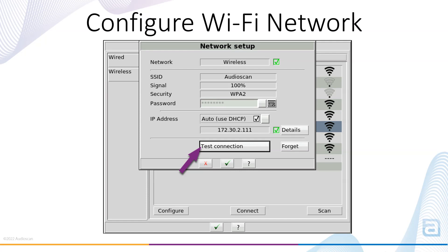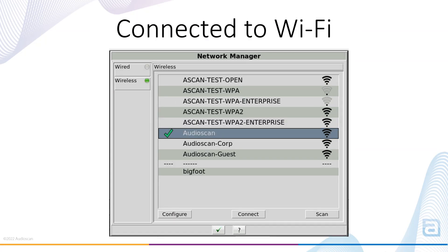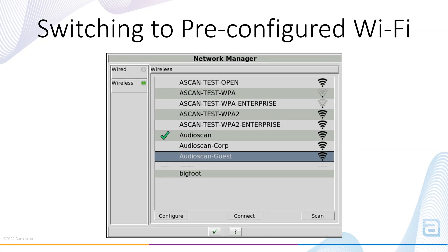At any time, the Forget button can be used to remove the configured password, so that the Wi-Fi password or any other configuration details must be entered to connect to the network again. Select the Continue button to proceed. Now this network can be quickly accessed at any time by choosing it from the list, and then selecting Connect.